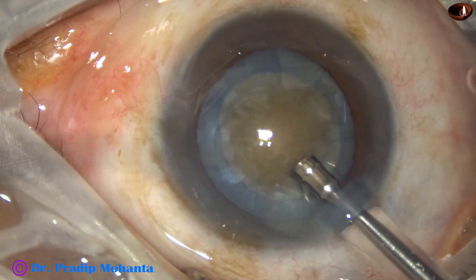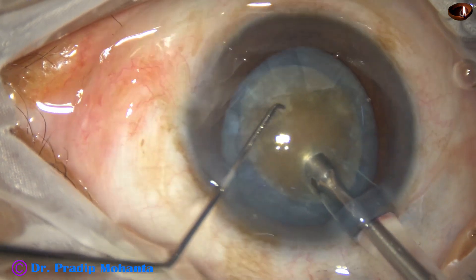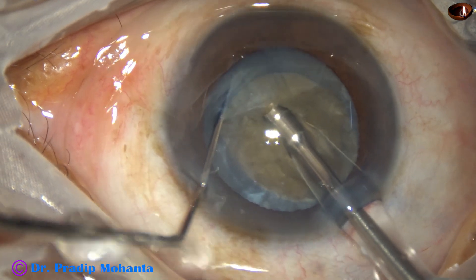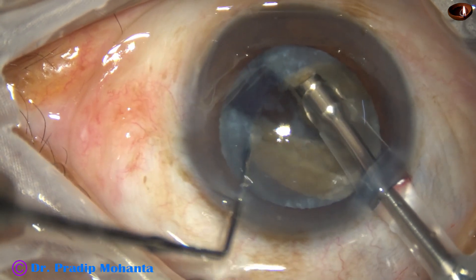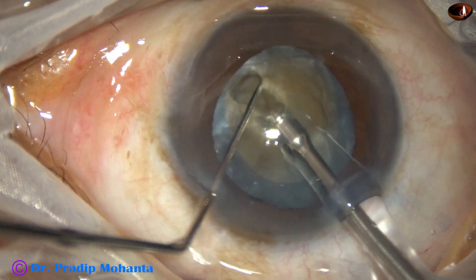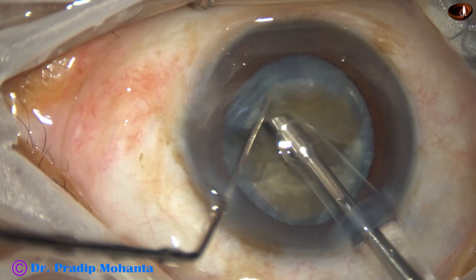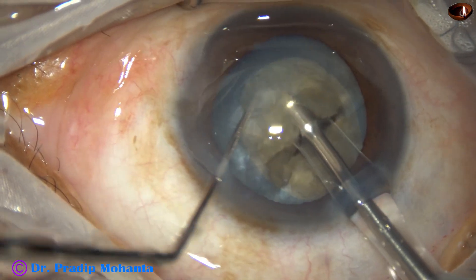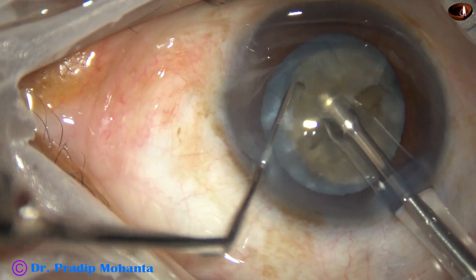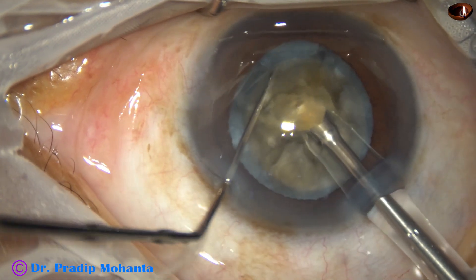Watch my submarine chop technique. The tip of the needle is buried in the substance of the nucleus. It goes through the substance of the nucleus towards the opposite equator as a submarine goes underwater. Now use the chopper to make a crack, then rotate the nucleus 180 degrees. Come to the other side, sculpt once or twice, go to a deeper plane, hold the hemi-nucleus, and with the hook-like Mahanta's chopper, separate the two hemi-nuclei completely. One hemi-nucleus has been subdivided into two fragments and this is the other hemi-nucleus — so we have four fragments in less than one minute.